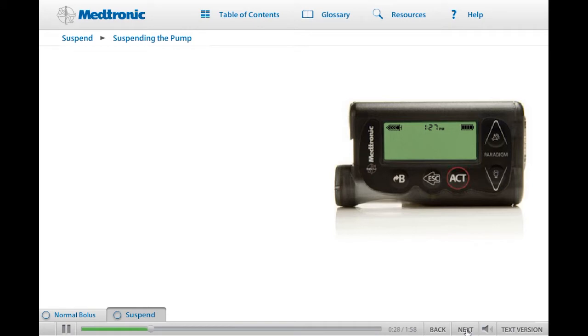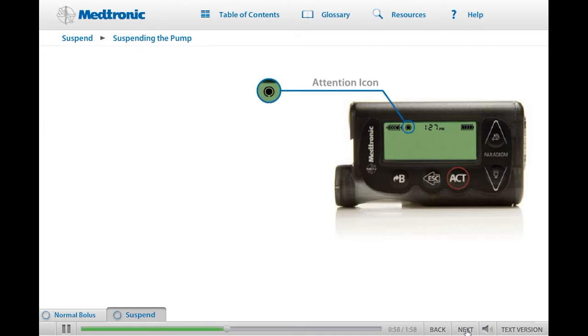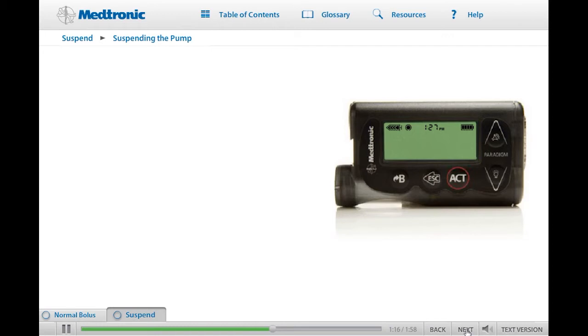First, we'll place the pump in Suspend. Starting on the main menu, scroll down to Suspend and press Act. The Suspend screen will appear with the word Suspend flashing on the screen. Press Act to stop your pump. Your screen will display the word Suspend and note the time it was stopped. In 30 seconds, the pump will return to the home screen to conserve battery power. Notice that the solid circle — the attention icon — is now displayed on the home screen, indicating that the pump is no longer delivering insulin.